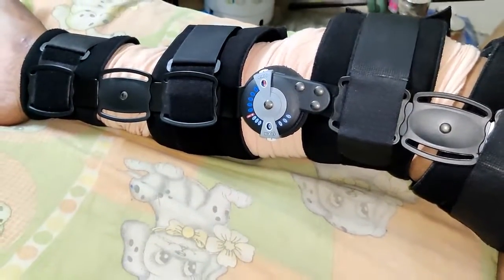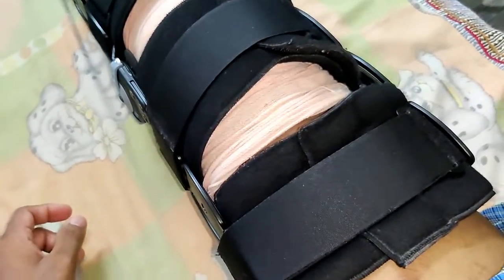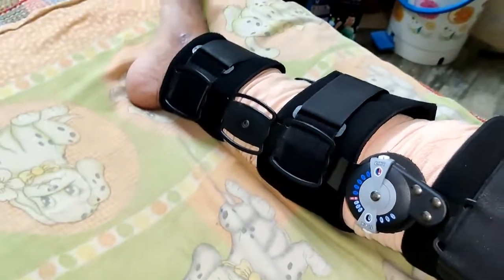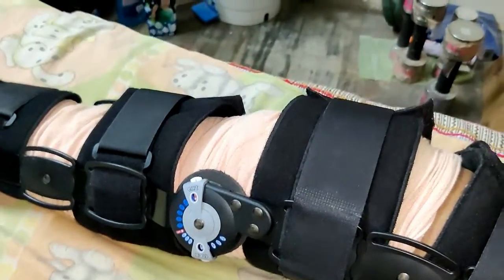Make sure you wear this ACL brace for up to six weeks so that you can get better stability. Be careful while riding bikes or doing any sports activities — don't end up having to wear this one again in the future, so be careful.